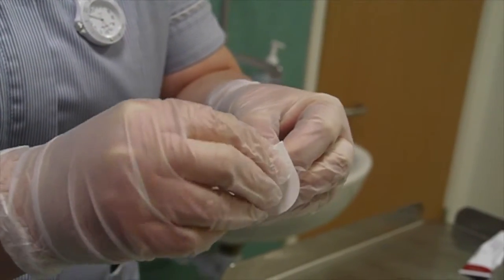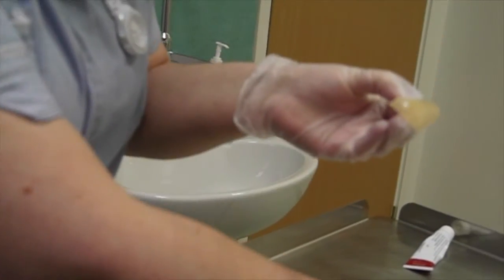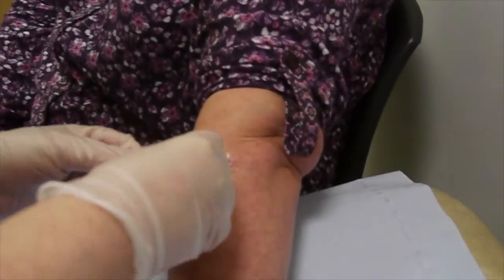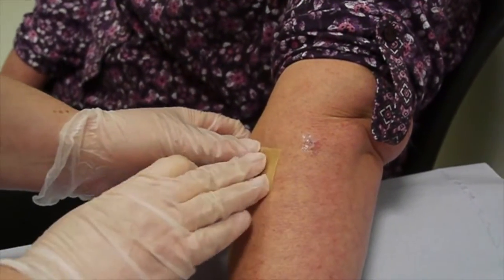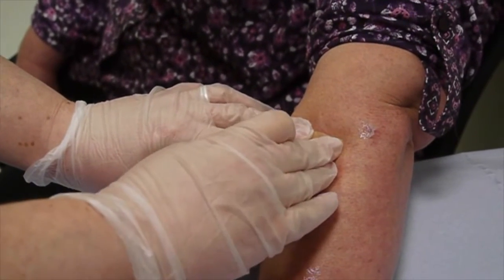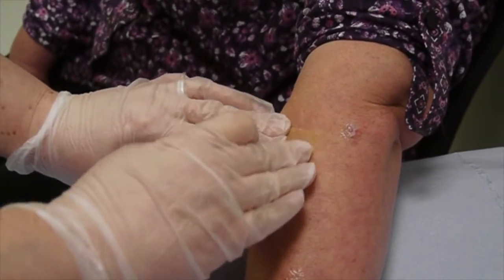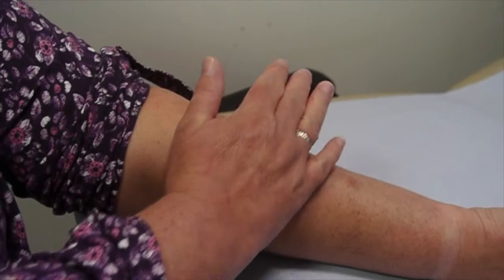The paper backing is taken off the back of the hydrocolloid dressing, revealing the adhesive side. Now the hydrocolloid is being applied over the ointment over the eczema, and the nurse is going to ask the patient to apply her hand to warm it for 20 or 30 seconds, which helps it stick more effectively.